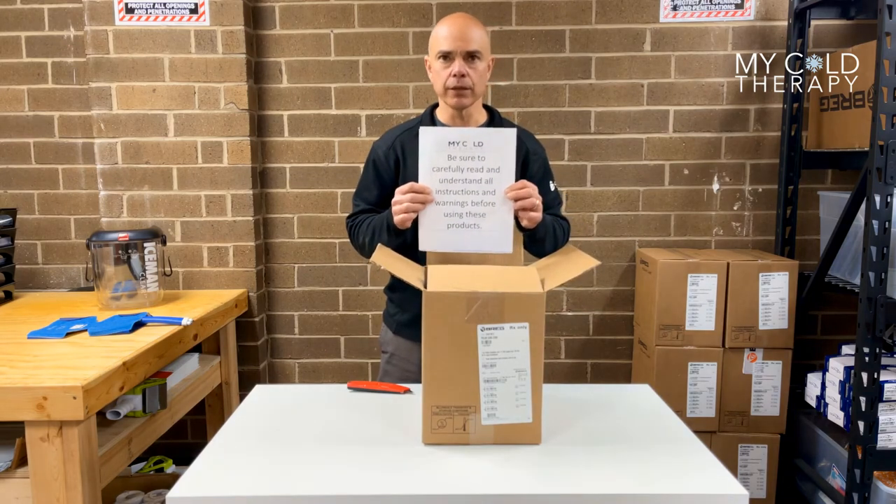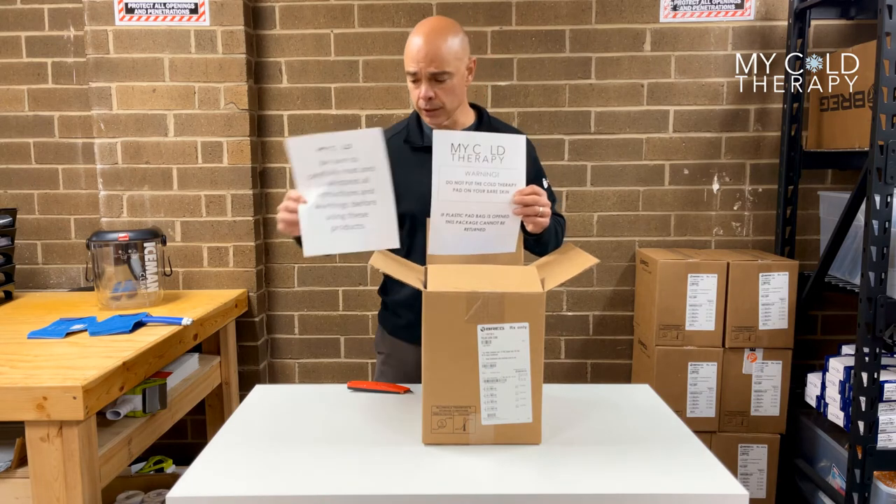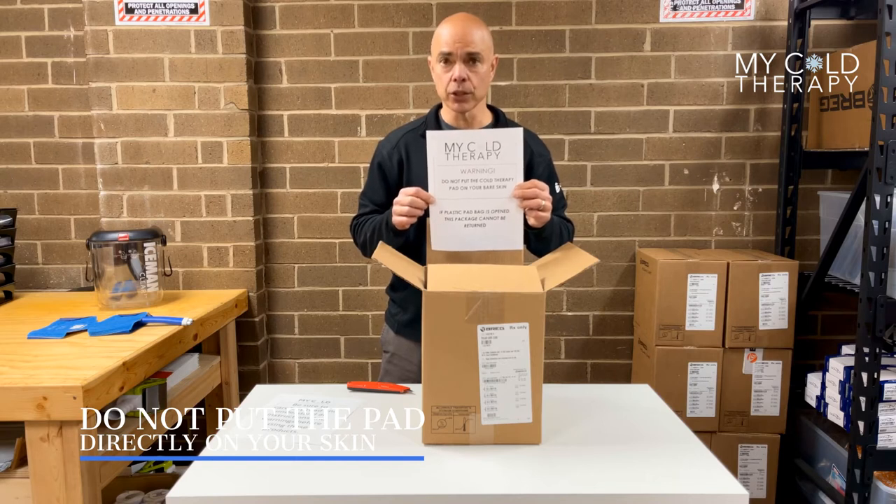The first thing you're going to get is two warnings. The first one is to read all the instructions and make sure you understand how to use the machine. The second one is the skin warning label — please do not put this on your bare skin because it could cause damage.